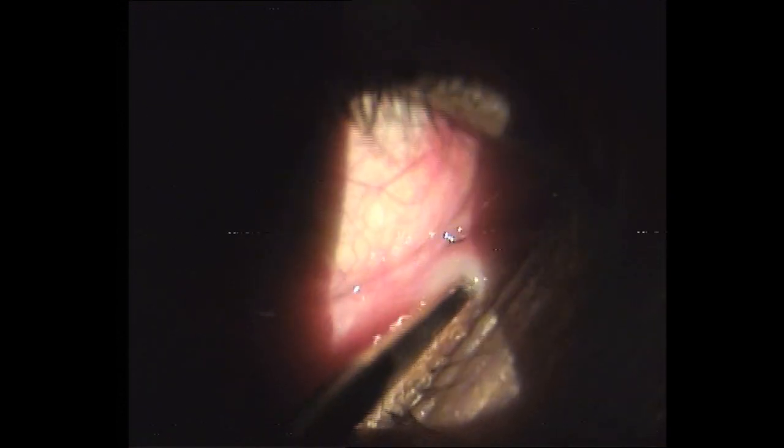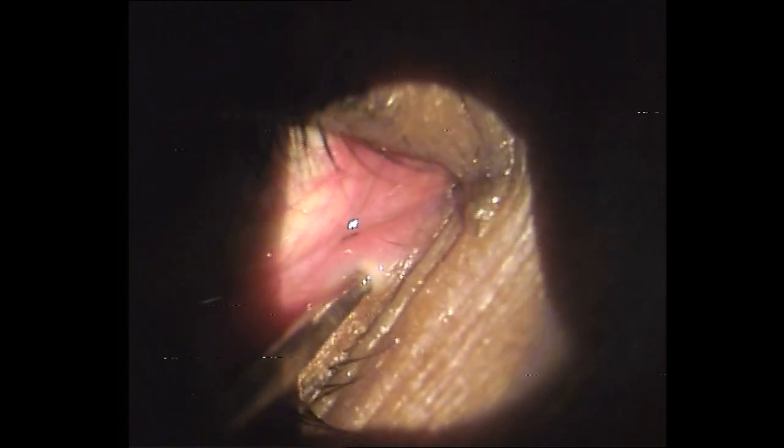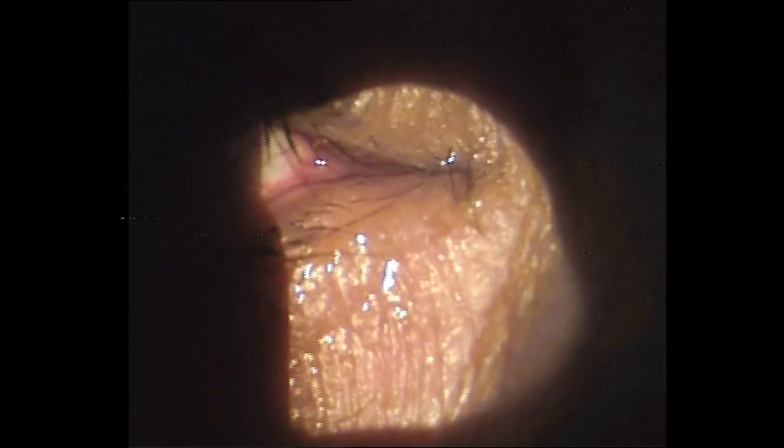So you're going to do it under topical anesthesia, using proparacaine, so the patient can only accept very gentle dilation. The important thing is to rotate the dilator in there, and just put it and push it gently forward so that the patient does not feel any pain. Once you've done that, you can see the amount you want to go in is such that the punctum opens up.